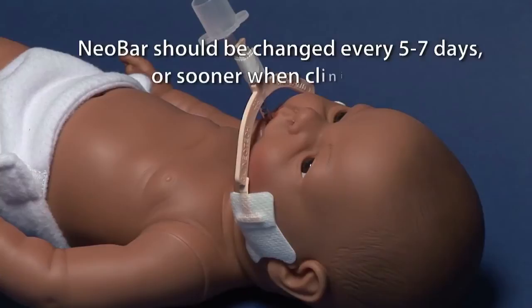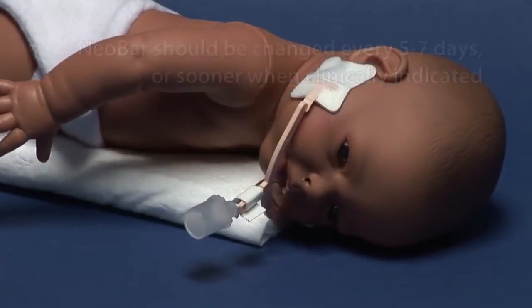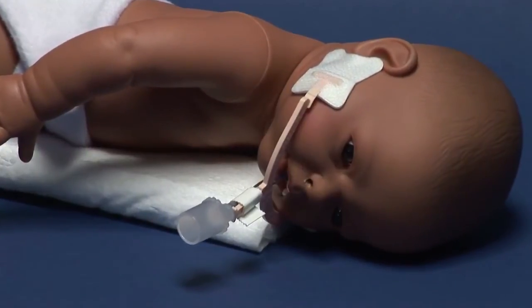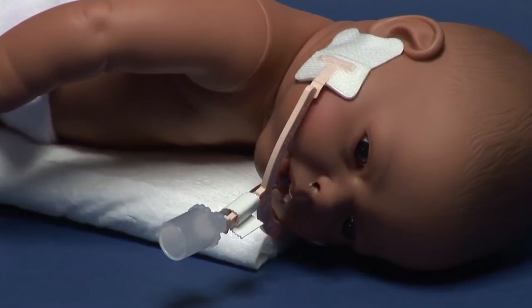Neobar should be changed every 5 to 7 days, or sooner when clinically indicated. The Neobar can be used whether the baby is supine or prone. You can use positioning aids for additional comfort.